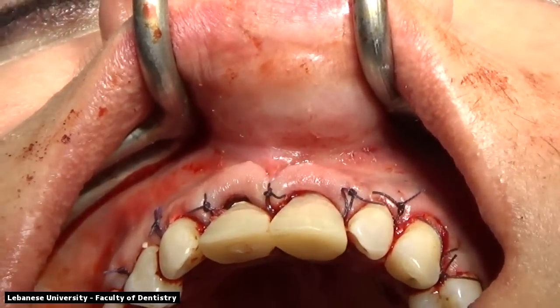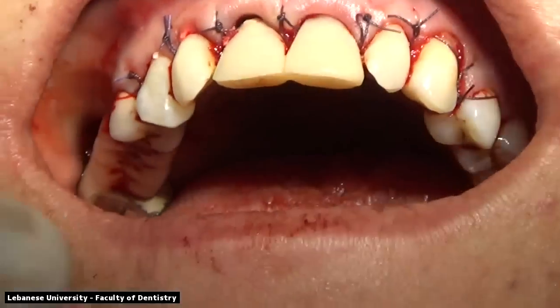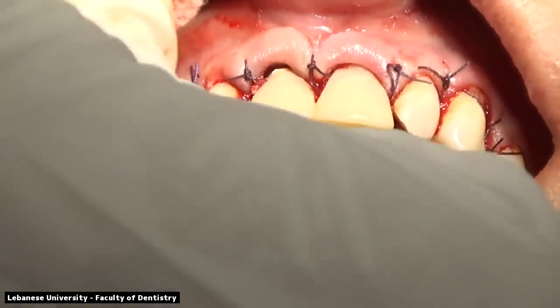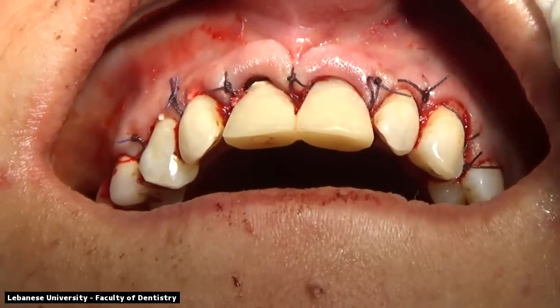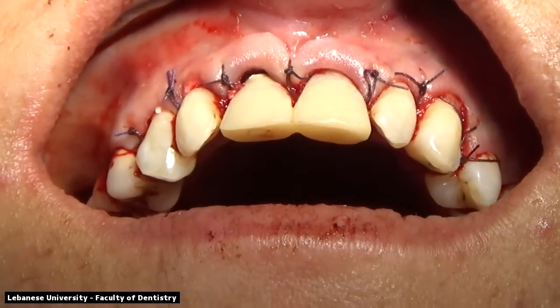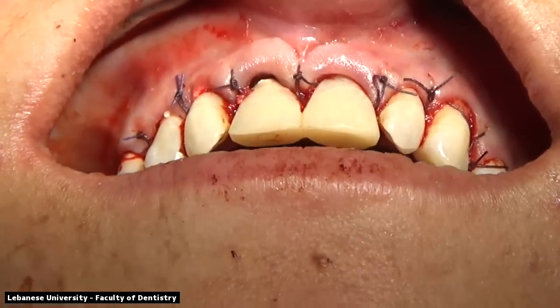These are the final restorations, cemented in place. The area is sutured all the way from the right canine to the left canine. The gingival marginal levels of the centrals are at the same level as the canine itself, and the lateral is slightly lower. We can appreciate the tightness of these sutures, but not too tight, so there's no pressure, but there's adaptability of this soft tissue.